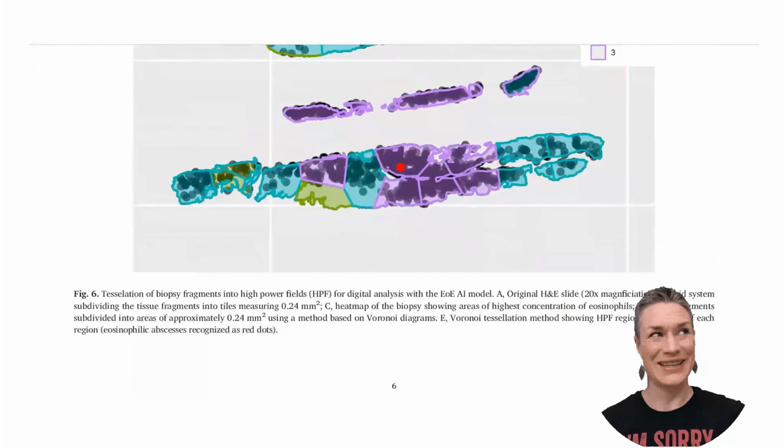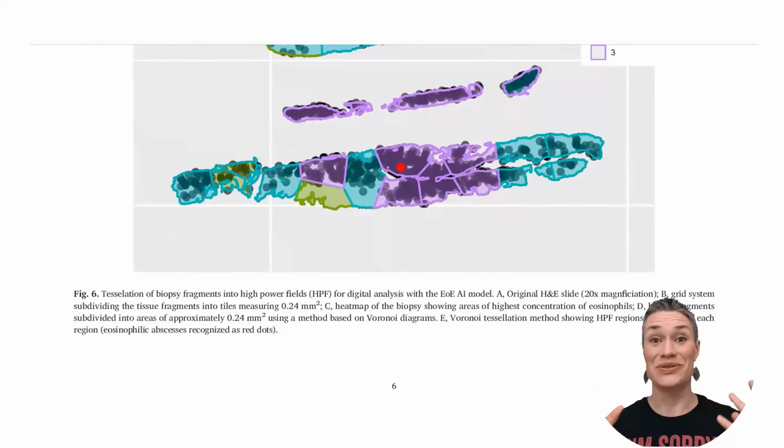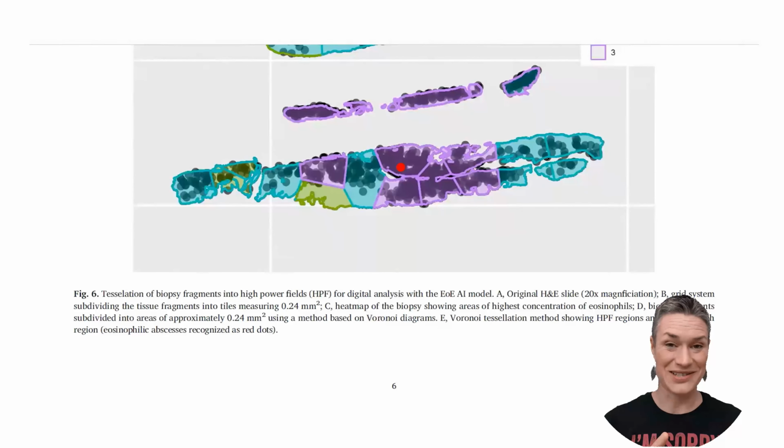So that's pretty neat. There's a lot of translation necessary to take the pathology scorings done with a microscope and translate it into a computer vision approach. And could we not do a different computer vision approach? Yes, we could. And here different features are added. But if we want to compare it to something that we know is working or is standard of care, an established method, we have to compare it to this visual scoring. That's why this computer vision approach is basically mimicking what a pathologist is doing under the microscope. But it's doing it in a more quantitative way. It's doing it on a whole slide. So we already have a lot of added value, even though we're mimicking the visual approach.